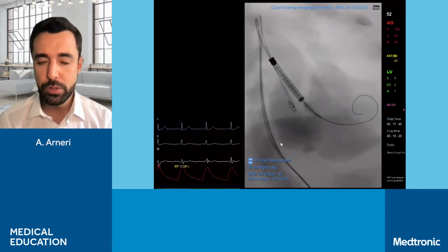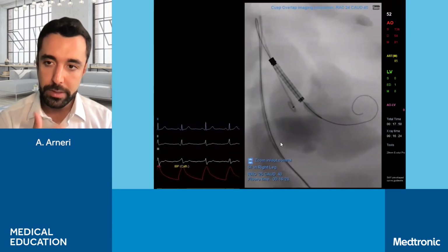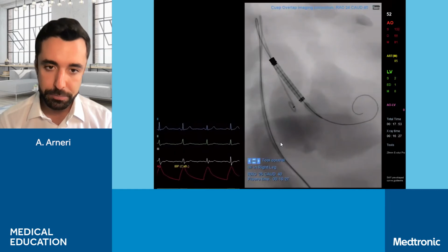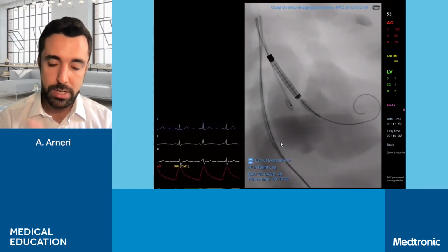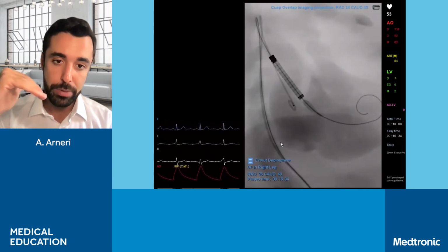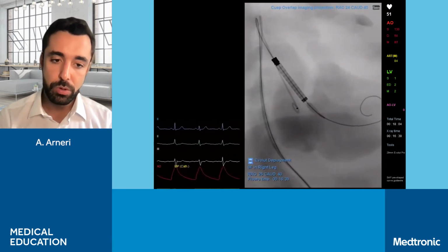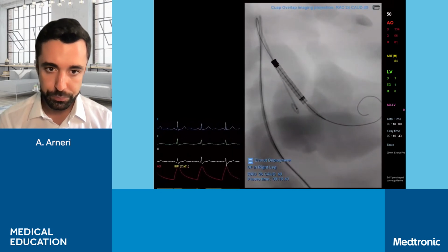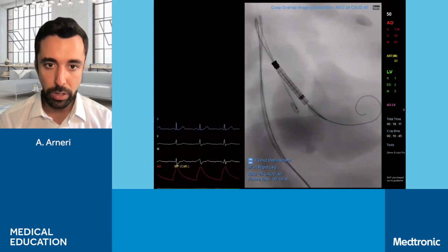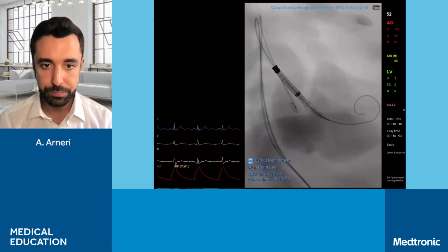So maybe nice now to start a bit higher in order to have the valve then in a higher position at 80%. Okay. And we are going to restart now. You see that head marker, the radiopaque marker is a bit in a higher position compared to mid pigtail. We're going to start now to release the valve again. Again, we are reaching the third node. Okay, we can stop now.